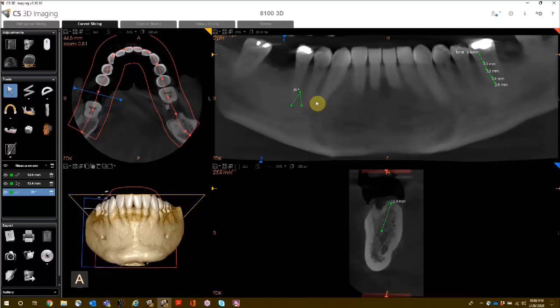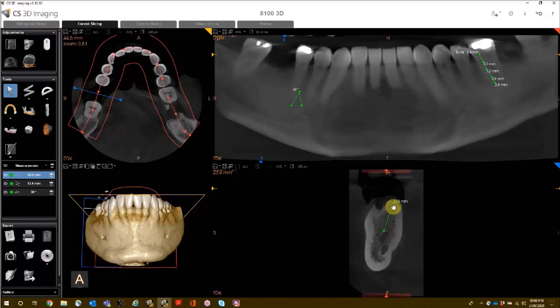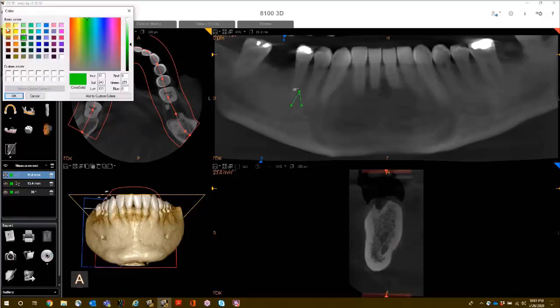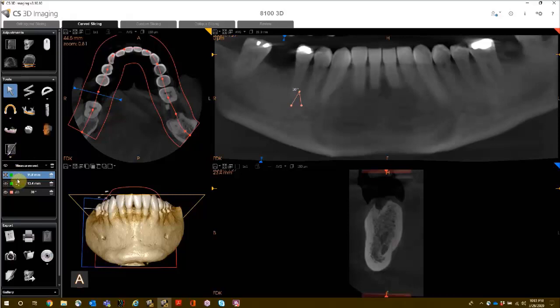At any point in time, you can move your measurements around by grabbing any of the control points. The options for your measurement include show or hide the measurement, change the color, or delete the measurements.